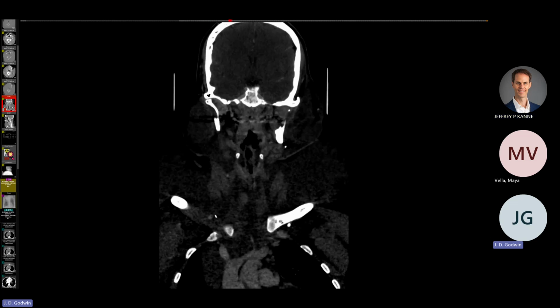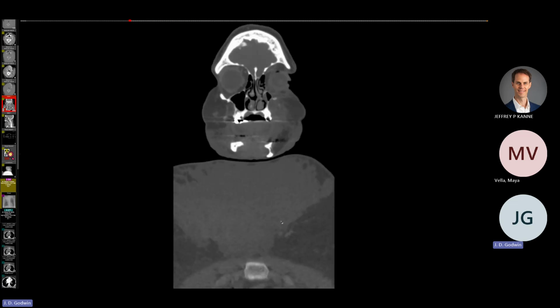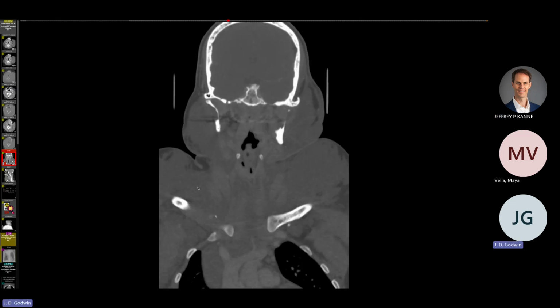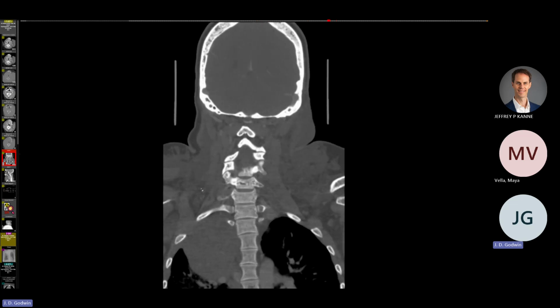So I think the better designation for these things is cystic hygroma, which is the term that was used when these things present in childhood. I think this woman is 39 years old. So this is an extensive lymphatic malformation here that had the terminology Gorham's, but I think better fits with cystic hygroma because there's very little bone involvement.